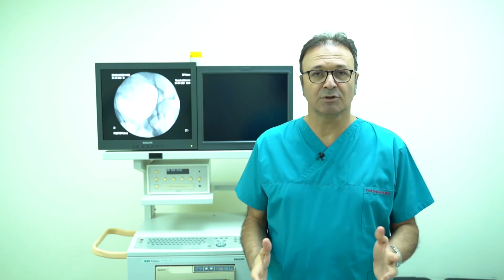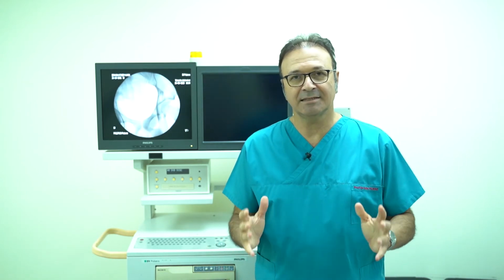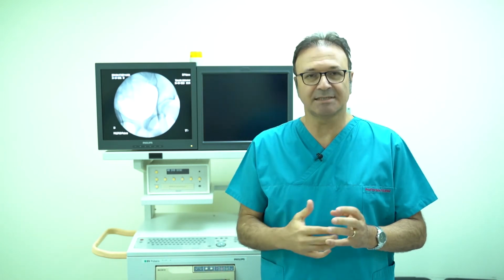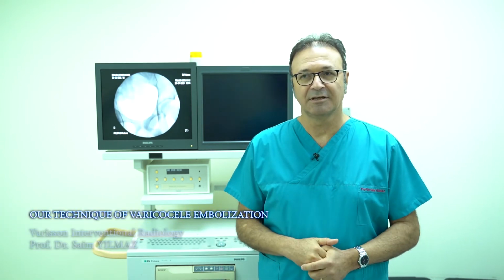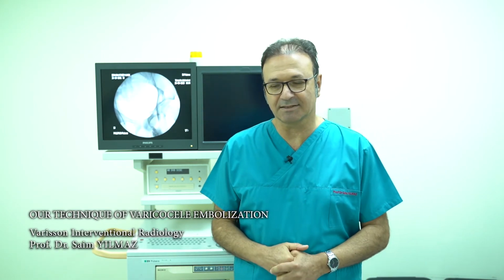As I told you, most of the time, the left internal spermatic vein that is located between the left renal vein and the varicocele is the responsible vein for varicocele. So during the intervention, we use angiography to identify this vessel.